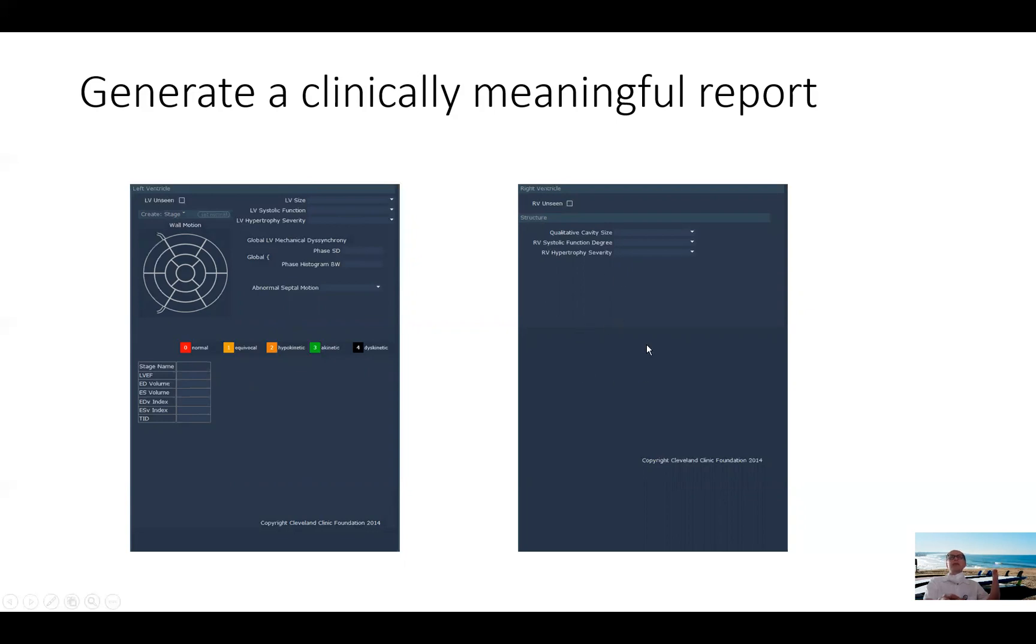The next page will be a comment about the RV function. This is the ventricle that we should not ignore. In PET, we see it reasonably well. We should comment about it because we comment about the function of the right ventricle, the size of the right ventricle. Patients right now are presenting with multiple comorbidities besides CAD. So this is an important parameter that should not be ignored. It should be reported.